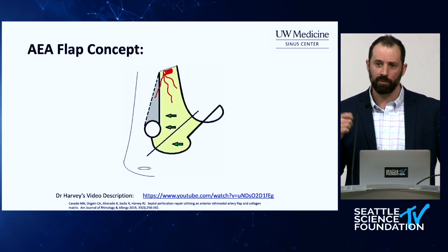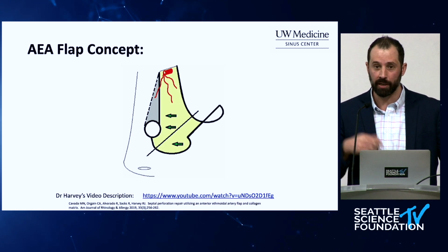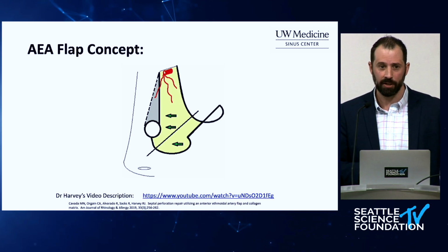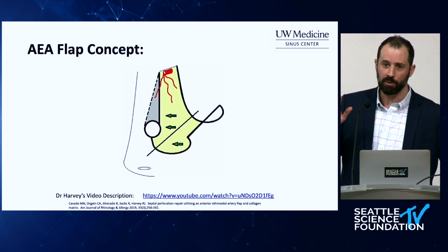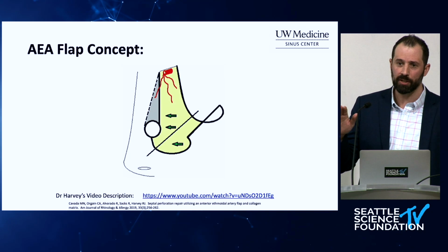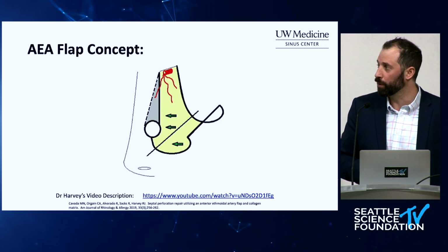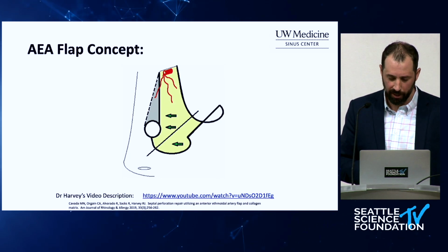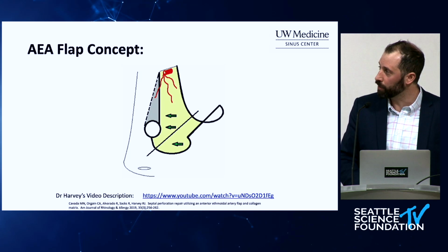Am I going to make this perforation significantly larger, either during the surgery itself or in aftercare and recovery, and have a surprise that I've actually made the situation worse? But in reality, it's just a wedge like we often use in facial plastics for mobilization of tissue. You can move this tissue in a very reproducible and productive way to cover this anterior septal perforation. So that's what I want to spend the rest of our time on, walking through the methods used to do this.